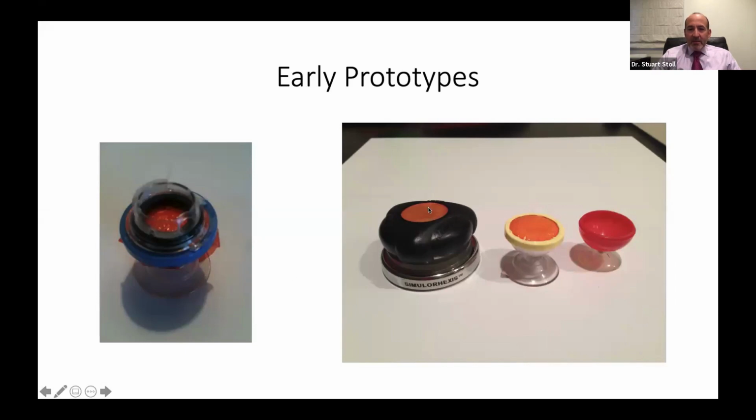And then that turned into a more robust model here that we used for TrueVision 3D as they were showing their 3D technology at the shows. And we got fantastic feedback on this. It worked well for a number of years to help people practice in 3D without looking through the microscope. And people kept commenting, well, where did you get this eye? Where did this come from? And so we knew we were kind of onto something, there was a need.